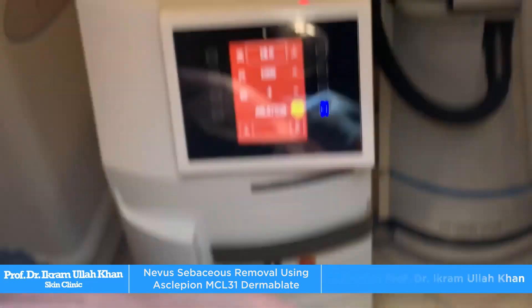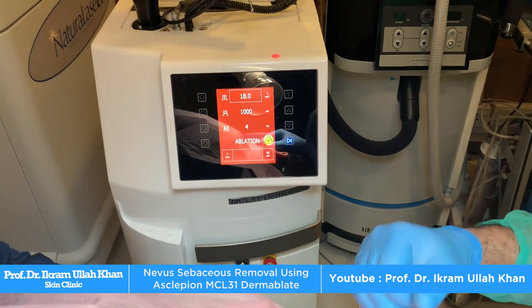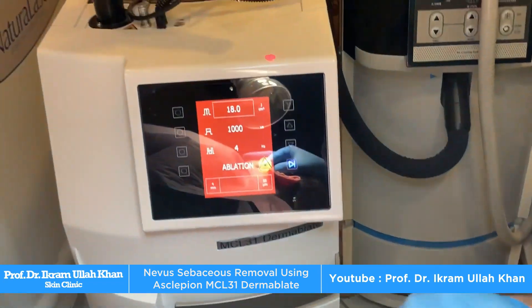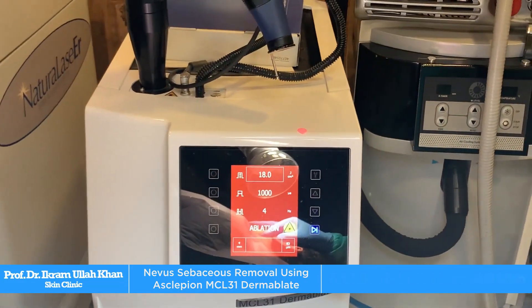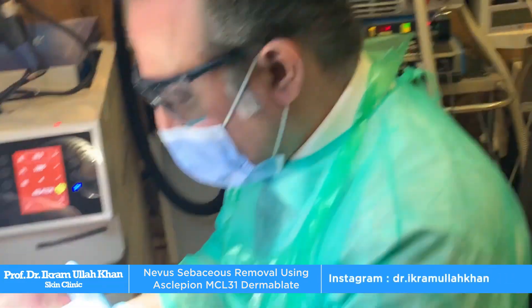Thank you very much. So, we have removed this with a laser. Basically, we have the criteria that we have to keep the pulse width very high so that it goes deep, and the ablation is less.